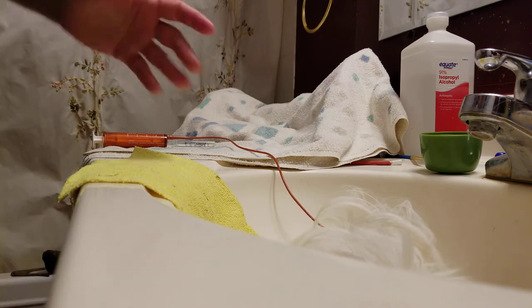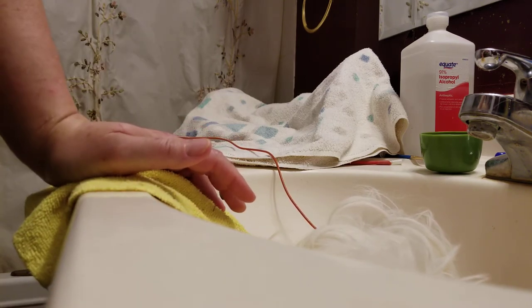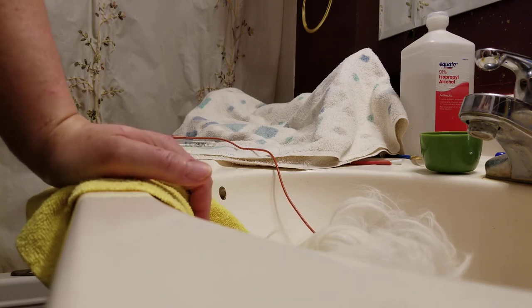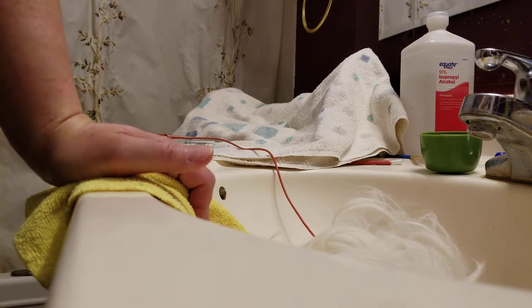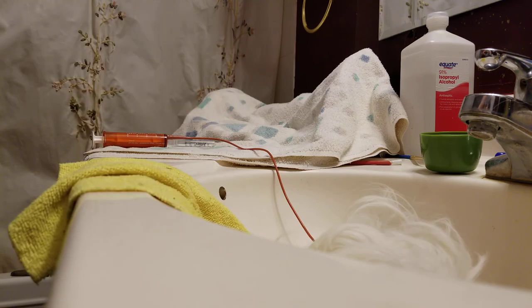You're going to want to make sure that you clean the catheter or feeding tube off well after each use. If you're using critical care, make sure you flush a lot of water through it, otherwise it's going to dry up in there and it will not be functional. I hope this is helpful for you guys — if you have any questions, feel free to comment. I appreciate you watching, thank you.